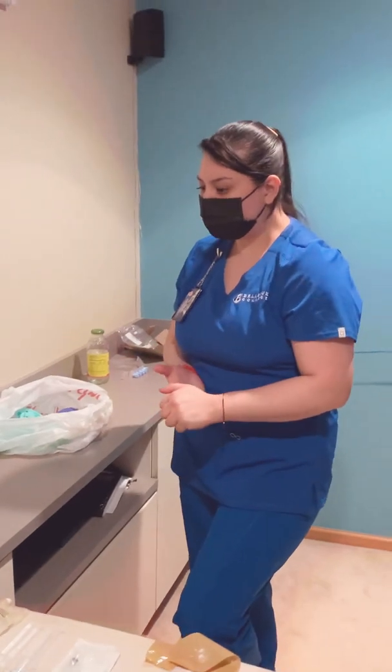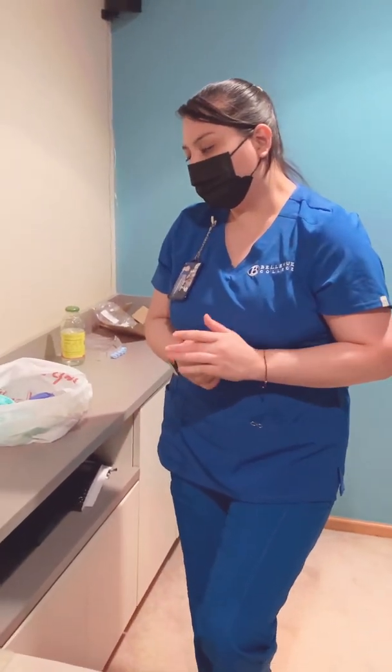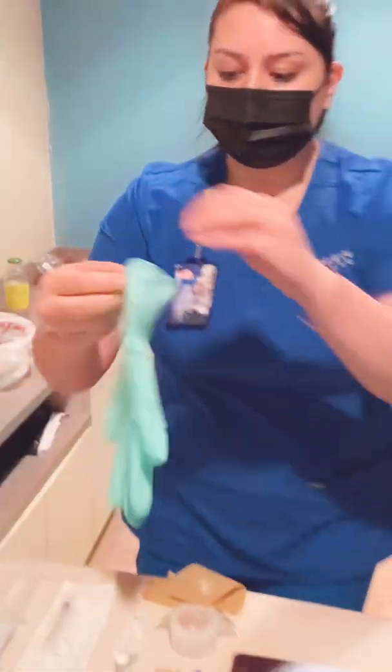So I am here because I need to administer some medications, with one being ondansetron for your nausea and vomiting related to an antibiotic medication called cefazolin, and that's for your UTI, and it's going to be infused in a 0.9% sodium chloride. Are you okay with me to proceed? Yes. Okay.